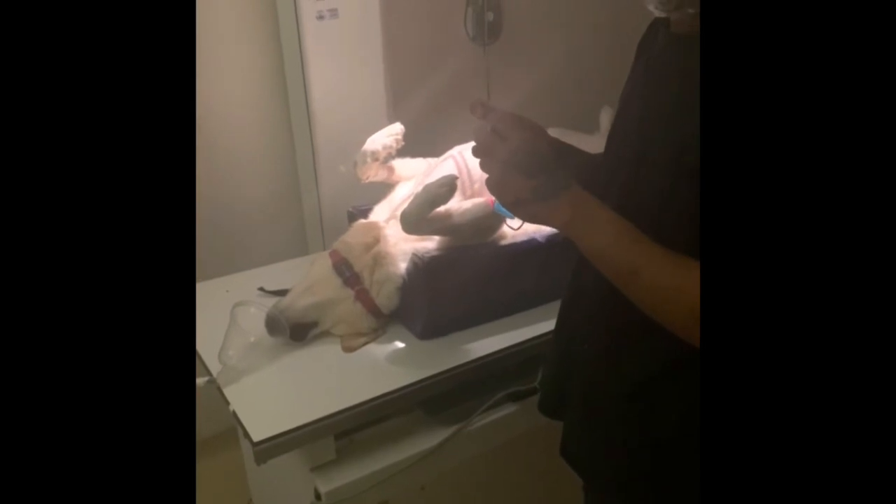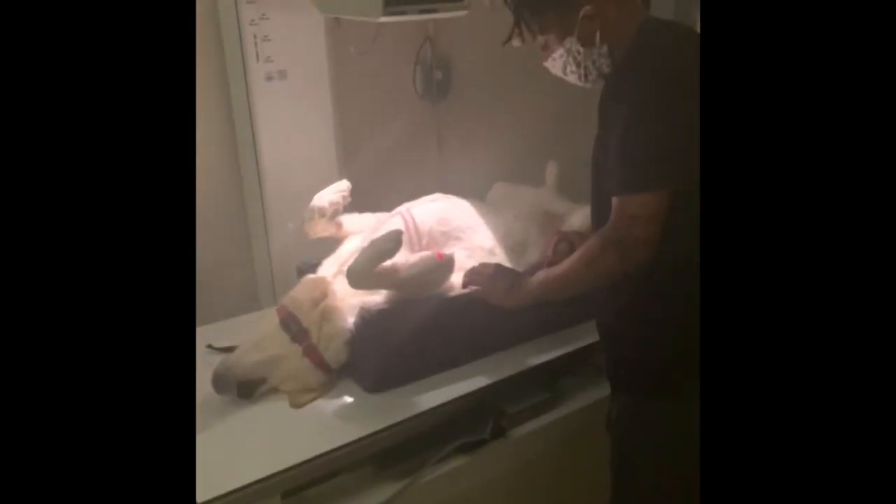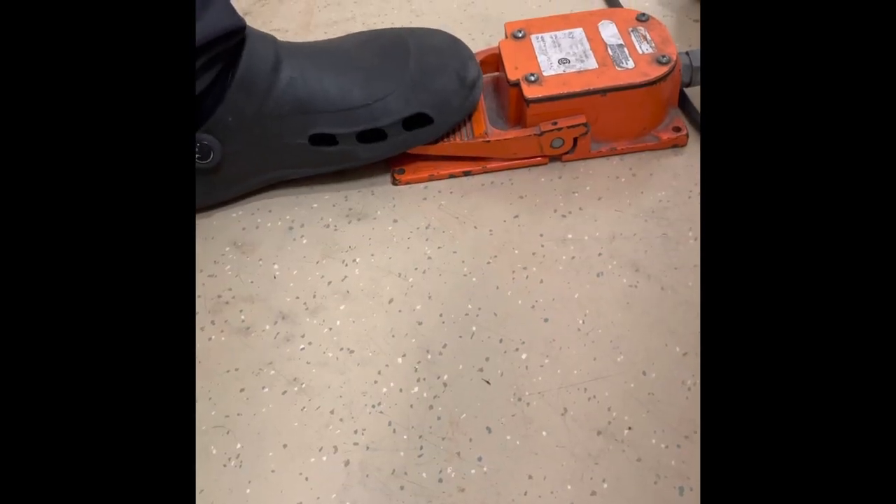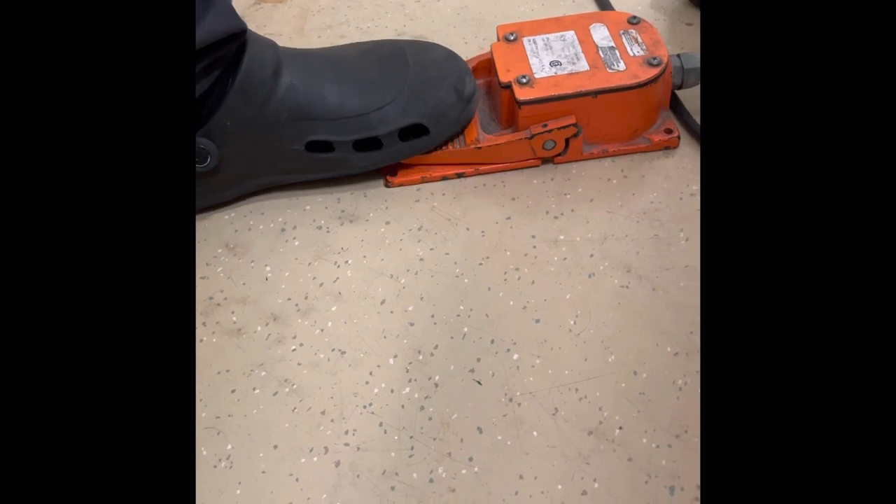Once I have him in position, I'll place my marker next to him to indicate which side is his right side. I'll get behind the glass cover, used to protect me from the radiation of the x-ray, since I'm not wearing a radiation suit. I use a foot pedal from behind the cover wall to take the x-ray.